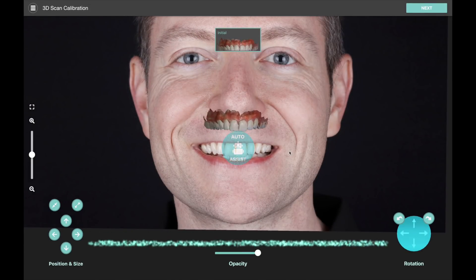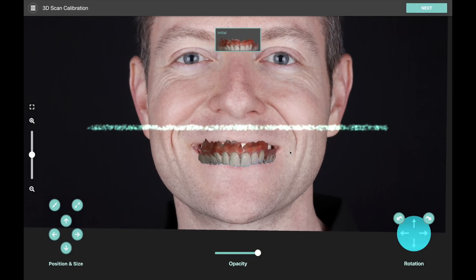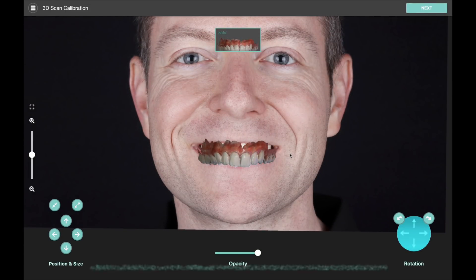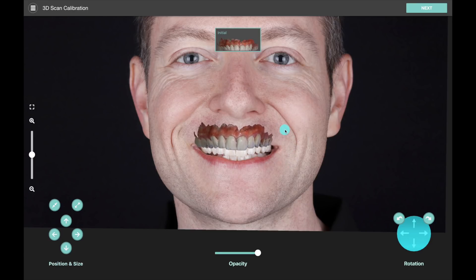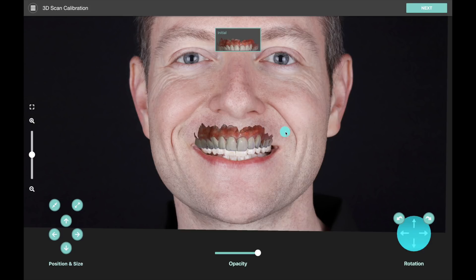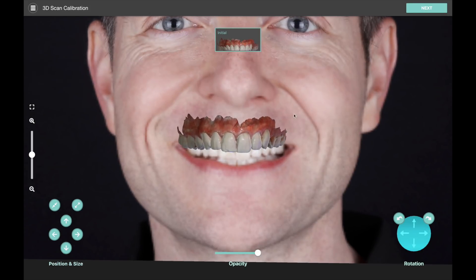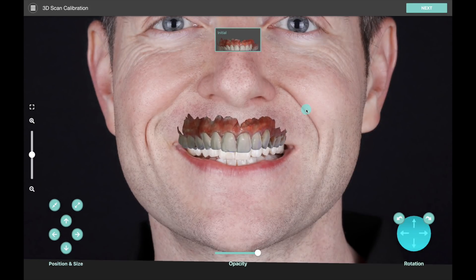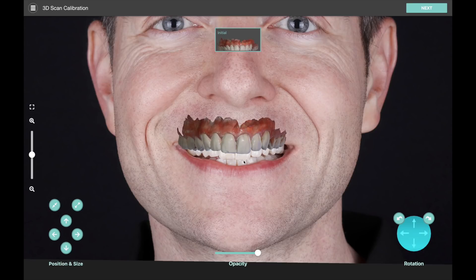Now when you bring in an intraoral scan file, there's an extra calibration step where we need to match up this 3D model with the position of the teeth in the photo. The software brings the model close to the mouth, but we still need to do the work of matching this up exactly with the position and orientation of the teeth in the photo.